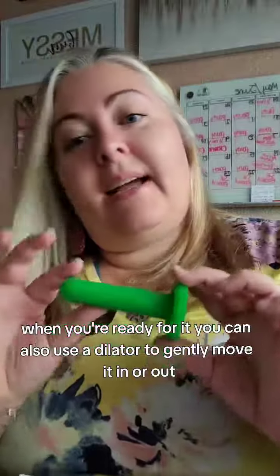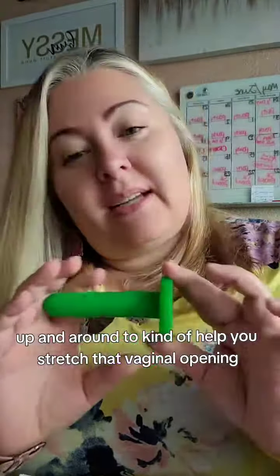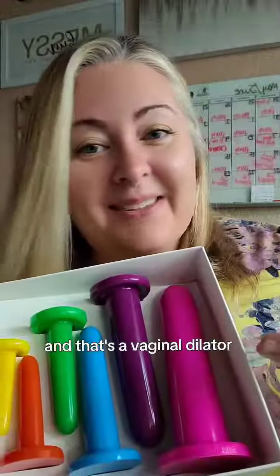You can also use a dilator to gently move it in or out, up and around, to kind of help you stretch that vaginal opening. You're going to want to go ahead and work through that about 10 to 15 minutes as your doctor recommends. And that's a vaginal dilator.